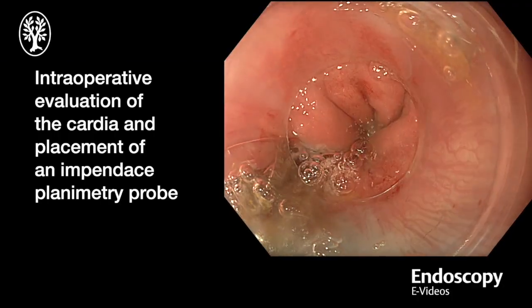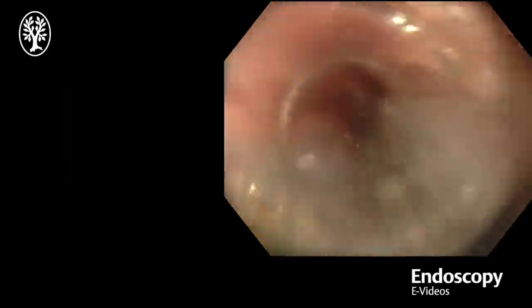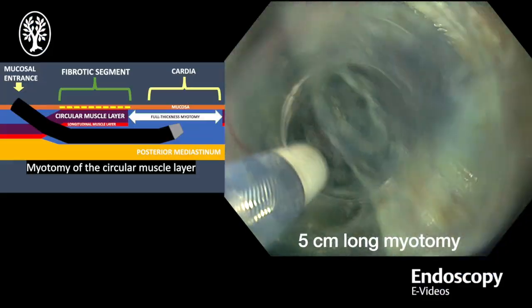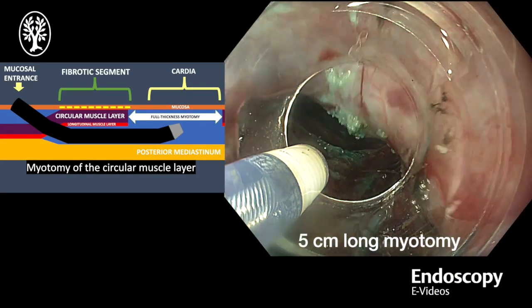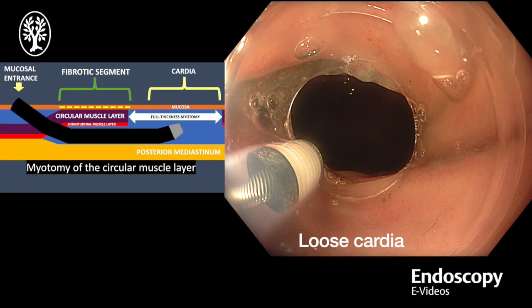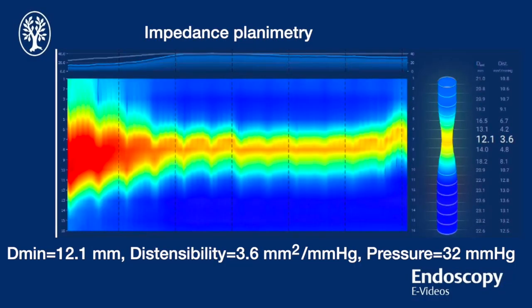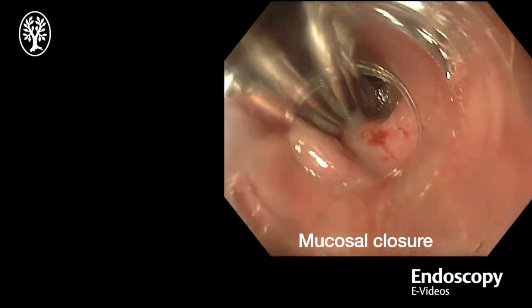During the procedure, the adequacy of the myotomy was evaluated by direct inspection of the cardia as well as by impedance planimetry, with initial values confirming the presence of a firm stricture. Progressively, the depth of myotomy was extended up to 5 cm. Adequacy of myotomy was confirmed by both direct inspection and impedance planimetry, demonstrating a distensibility index of 3.6. The mucosal entry was closed with endoscopic clips.